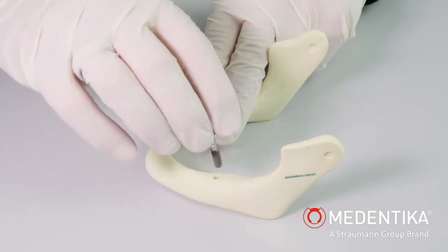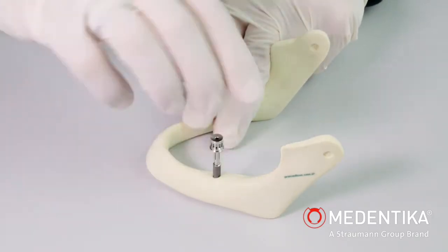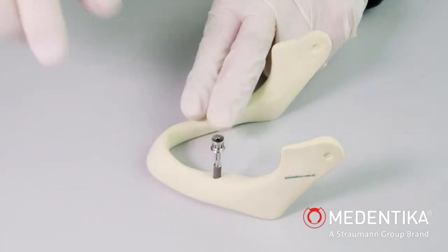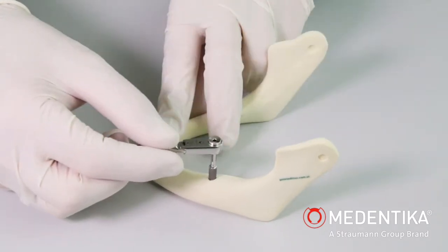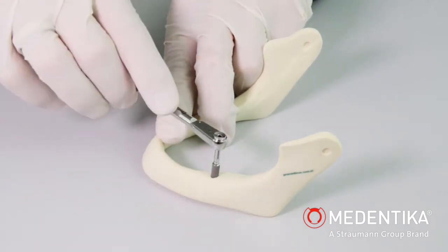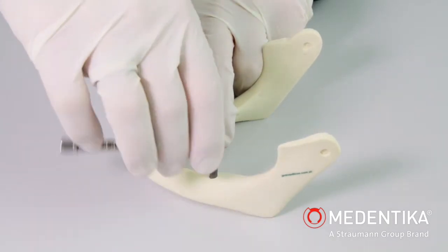Mechanical manual placement can be used as an alternative to power-assisted placement. Using the handheld shank placement instrument for direct removal of the implant, the implant can be inserted manually with the aid of a torque ratchet. The torque ratchet should always be used for final positioning of the implant to ensure that the torque of 35 Ncm is not exceeded.